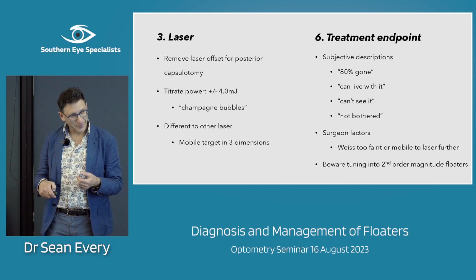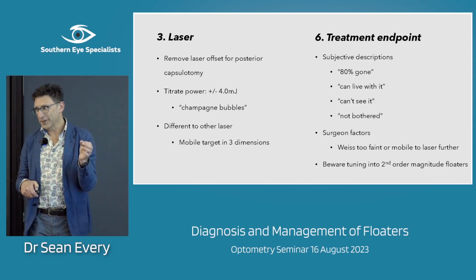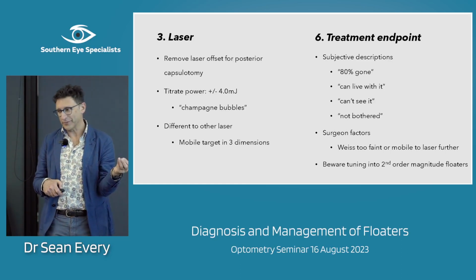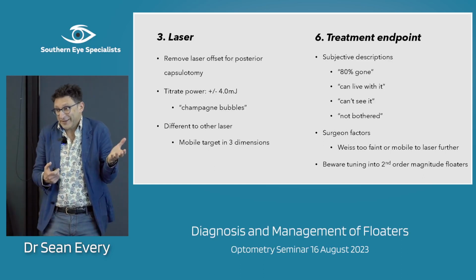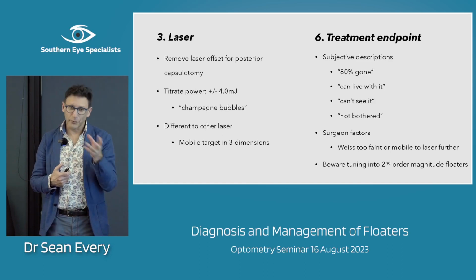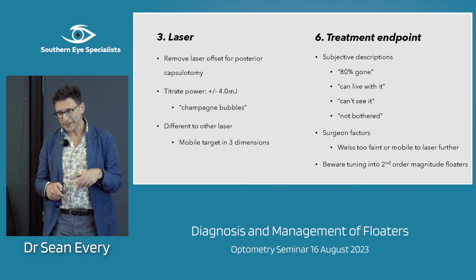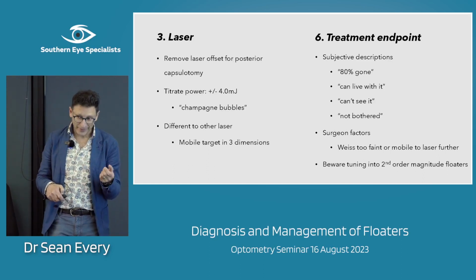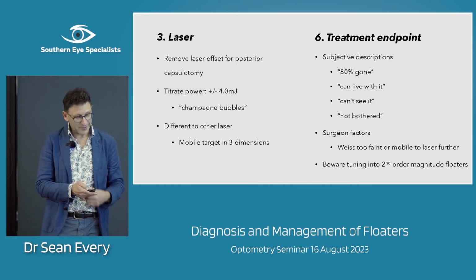This is another phenomenon I've realised: if you get rid of their dominant floater, some personality types start tuning into the next order of magnitude of floaters. That's what the brain does, that's what discriminating brains hunting perfection with floater removal start doing. So of course, YAG vitreolysis is not the procedure for them. They need a vitrectomy. But that's a really interesting phenomenon that I've tuned into.